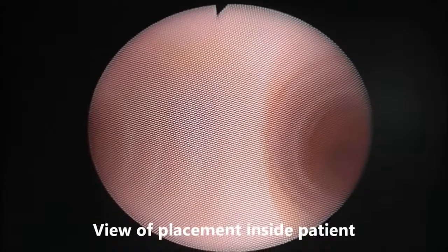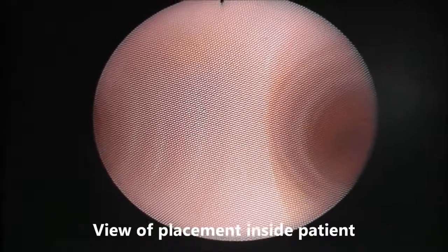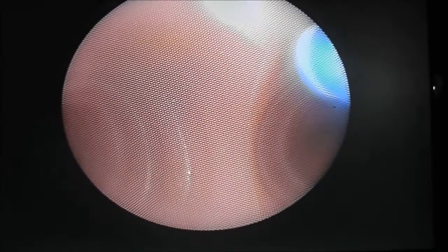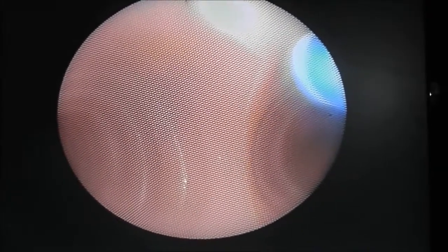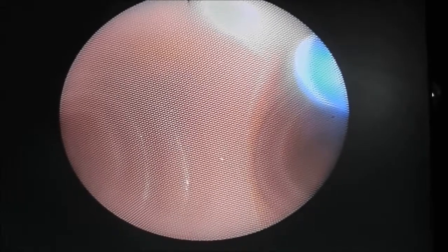Once you've intubated the patient, advance your fiber optic scope down the endotracheal tube to the level of the carina. Once there, advance your bronchial blocker to the same level. Using a twisting motion, you can direct the bronchial blocker into either the right or the left main stem.